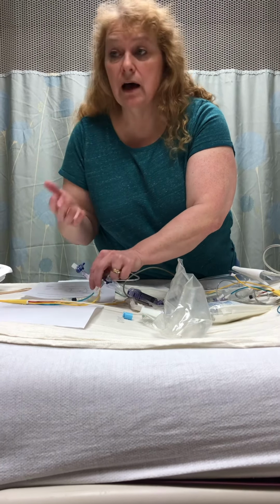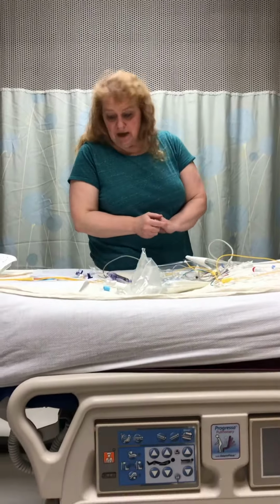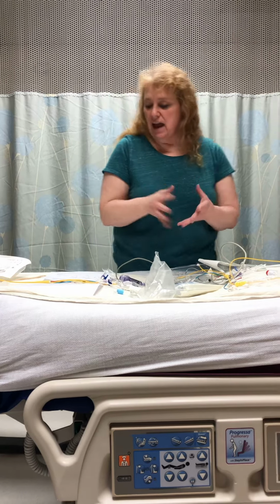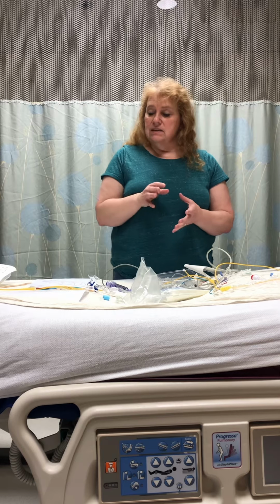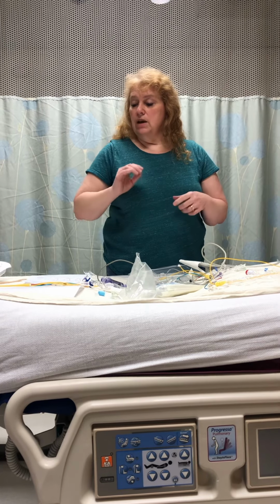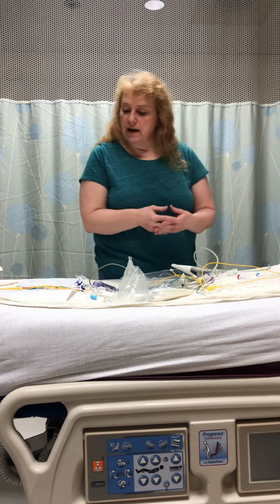You'll be able to tell if your line is well flushed: your blood is gone, and you'll have a good waveform back on the monitor again. Also double check your square wave test afterwards to make sure it's still good. Looking at your SVO2, normal is 60 to 80. If it's low, somehow your tissues need more blood flow, more oxygen. So either you increase the blood flow, increase your cardiac output.